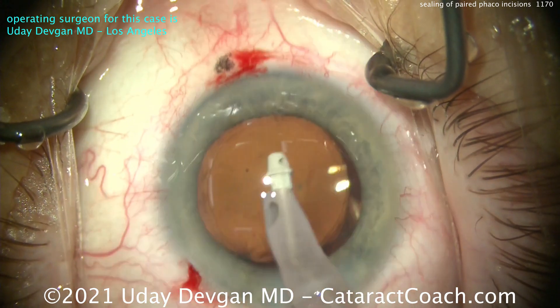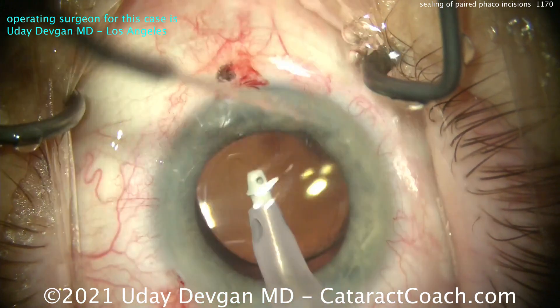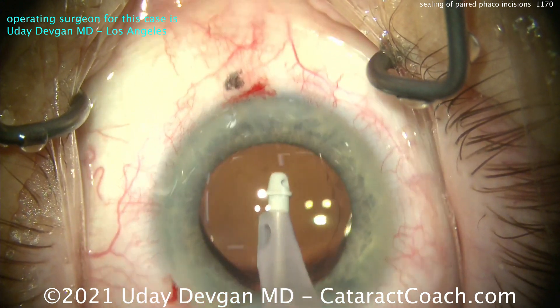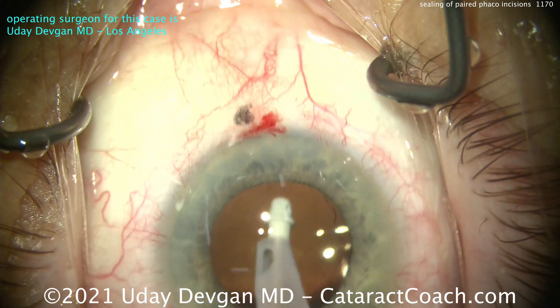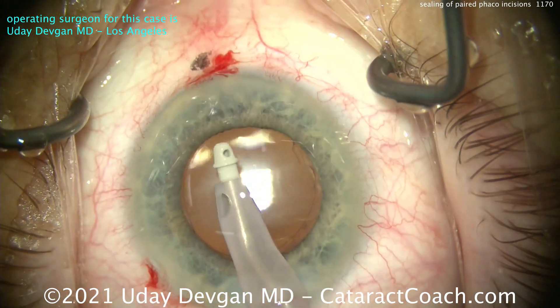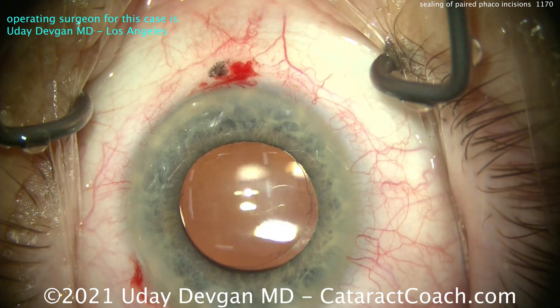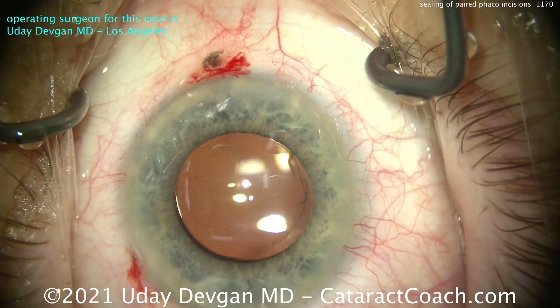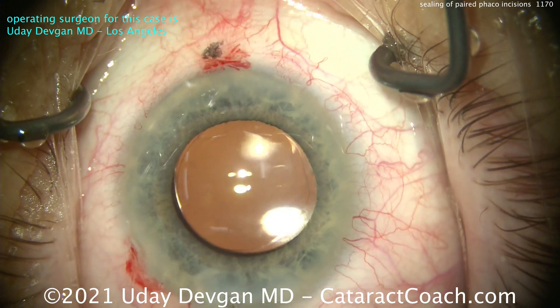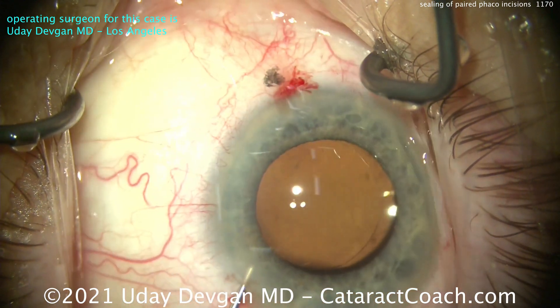Going behind the lens — again getting eye pressure many times normal. And look at that incision we made at the top of your screen: no leakage at all. I'll show you at the end of the case to prove it to you. If you make a beautiful incision for astigmatic purposes like we've done here — a paired phaco incision — and you don't use it in the whole case, it's going to seal beautifully. Don't let anyone tell you otherwise. You can check it, and let me show you.